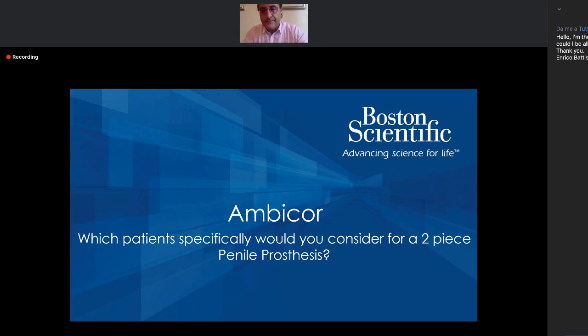Thank you for that. Appreciate it. Again, what we're seeing is really what all of our faculty have alluded to, is those patients that have had extensive abdominal surgery where you wish to avoid placing a reservoir in their abdomen might be the primary consideration for the use of an Ambicor. In certain markets, it may be a cost element to it, definitely.